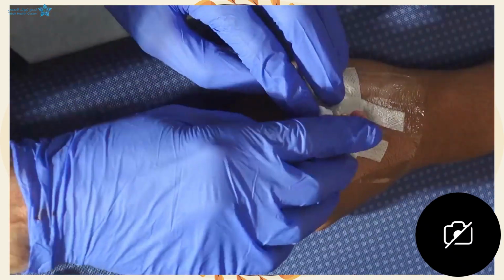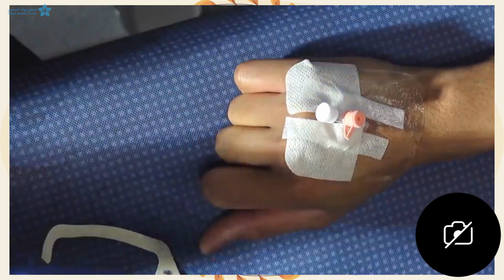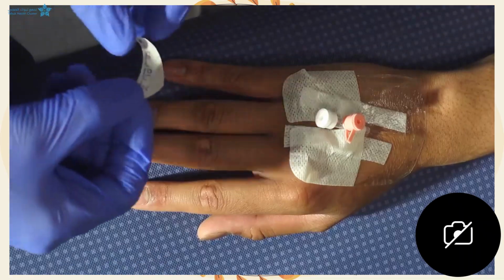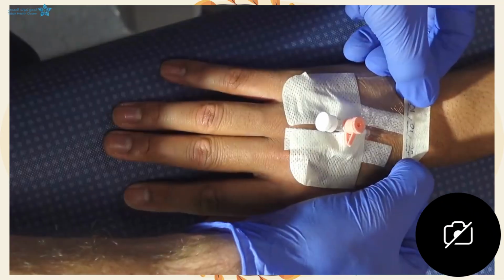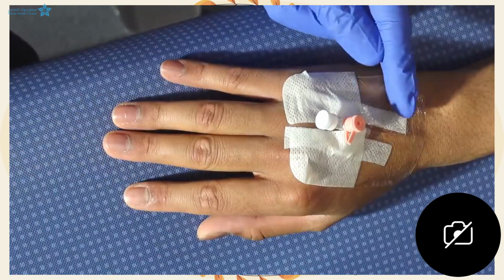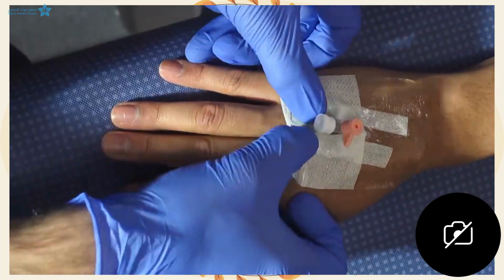Then we're going to close the port and we're going to apply the dates to the cannula. Some people do apply them higher up, but it's much better to apply them low down under the port so that we can see the cannula site at all points in case we get evidence of infection, such as erythema.